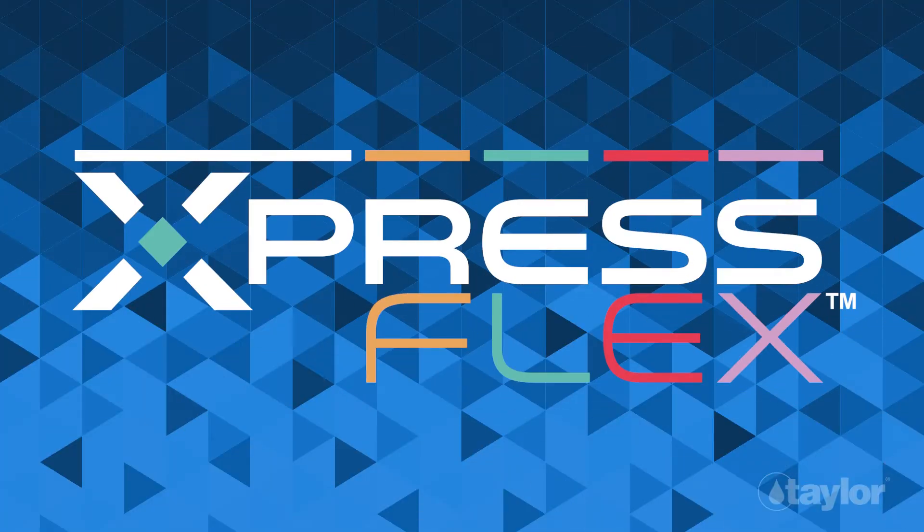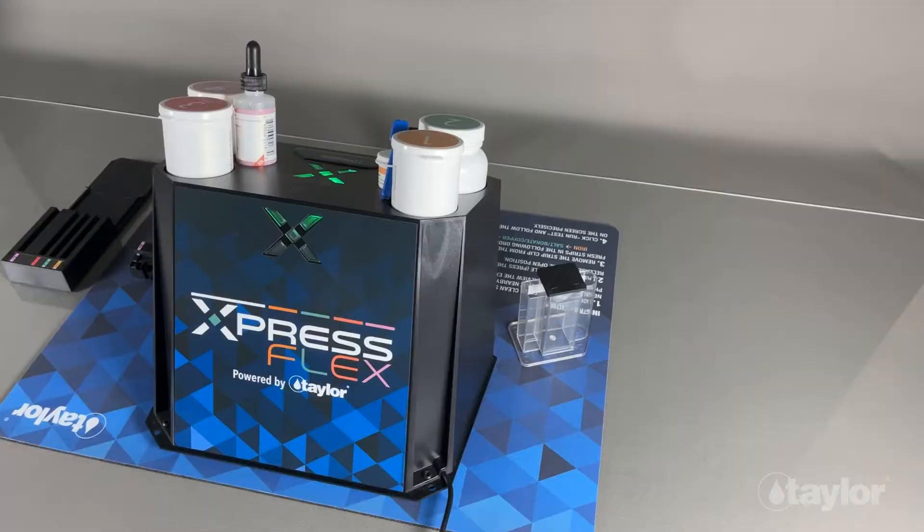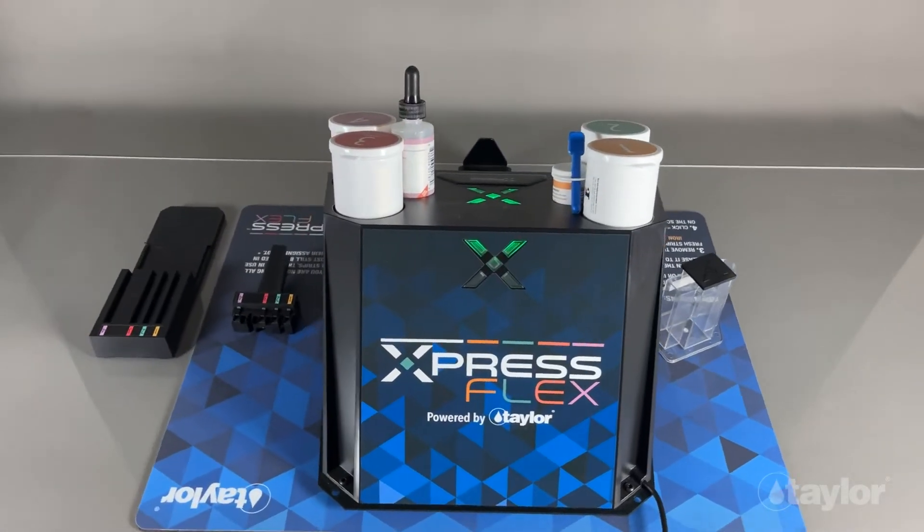Thank you for choosing ExpressFlex, the next evolution in in-store water testing. ExpressFlex is an advanced test strip reader from the most trusted name in pool and spa water testing, Taylor Technologies.